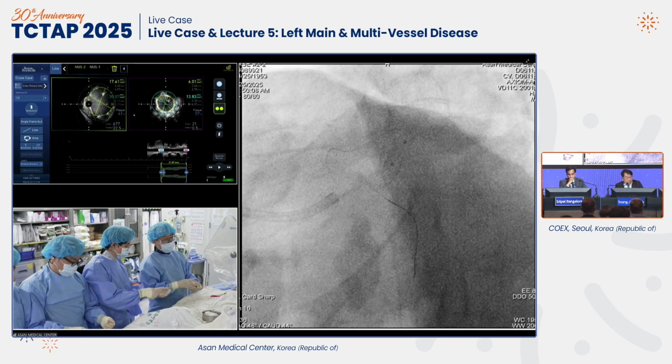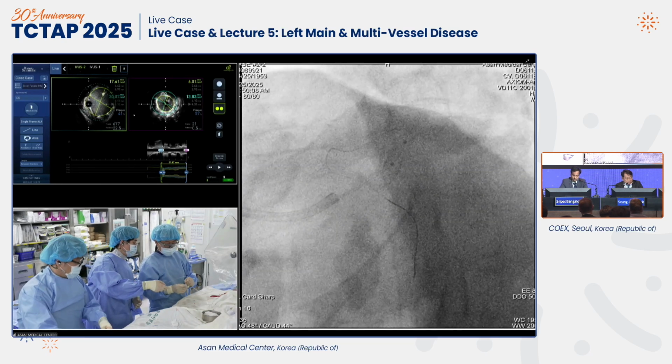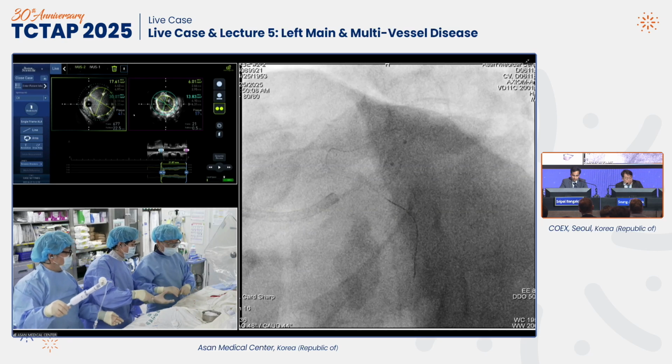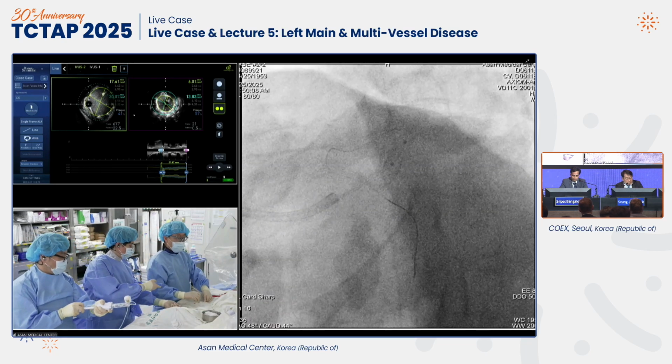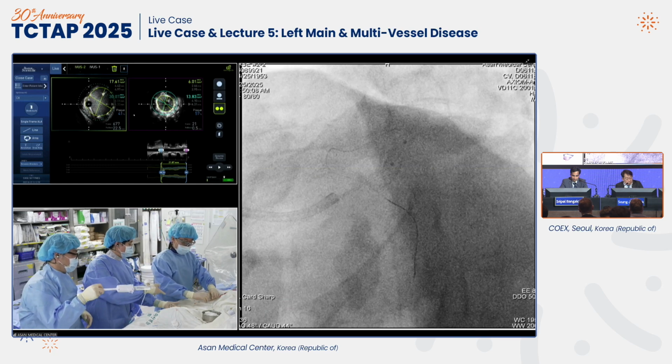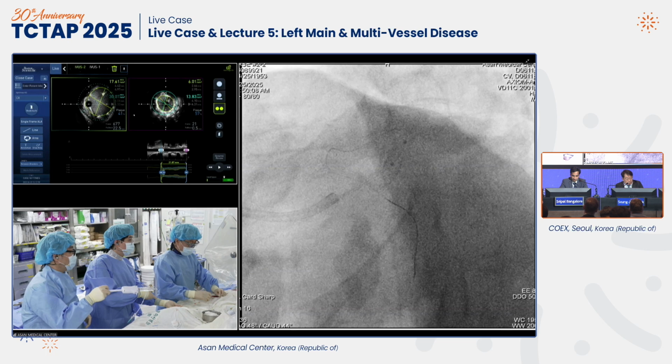Yeah. So firstly, we discussed the live case, the people and the meeting, with SJ Park and our team, and our plan. Just balloon angioplasty of the circumflex ostium and applying TAP may not work, we guess. So we are trying to do finally a 2-stent technique.